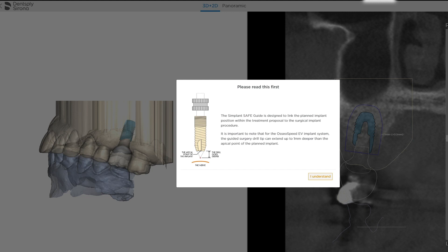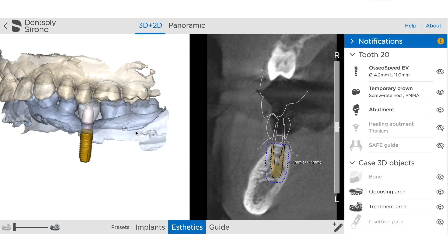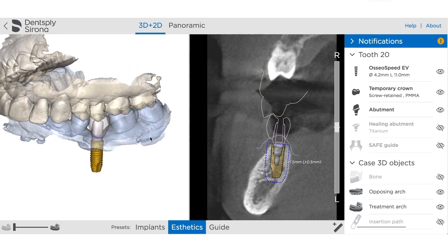About a day later you're going to receive a plan. As soon as you open the plan for the first time with the EV system, it's going to warn you that the drilling will be approximately a millimeter longer than where the final apical position of the implant is going to be. You need to make sure you understand that — it's important to keep in mind if you're altering the position of your implant.